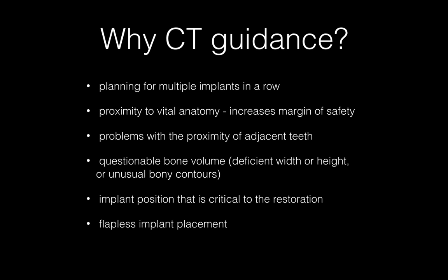If there's questionable bone volume, meaning if there's a deficiency in the width or height, or any unusual bony contours. Implant position that is critical to the restoration. Especially in anterior or front teeth, you want it to be lined up exactly as symmetrical with the neighbors so that everything looks aesthetic. It can also allow for flapless implant surgery.